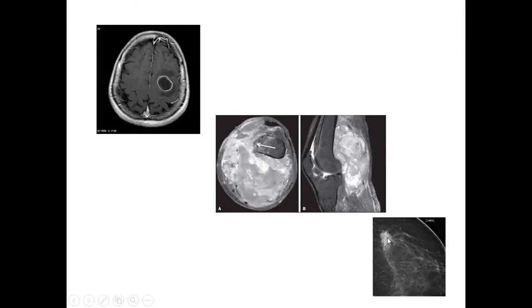In this case, it's a spiculated mass within the breast here, and this is most likely to be a malignant primary. But all I'm talking about now is soft tissue masses. They're either benign, malignant, primary, or secondary. I sometimes ask the medical students, tell me about gallbladder tumours, and they look at me as if I'm talking from outer space. And I say, you know exactly how to talk about gallbladder tumours. And they say, well, we don't, sir. We don't know anything about gallbladder tumours. Well, you do, because they're either benign, malignant, primary, or secondary.